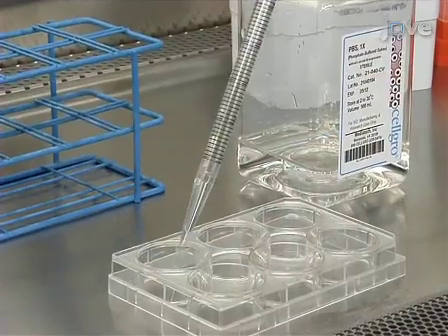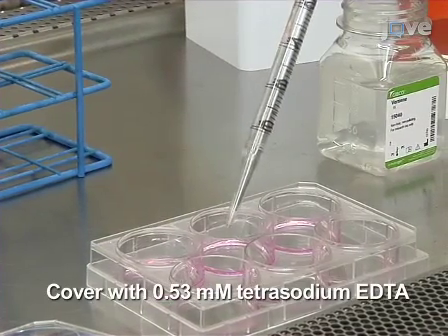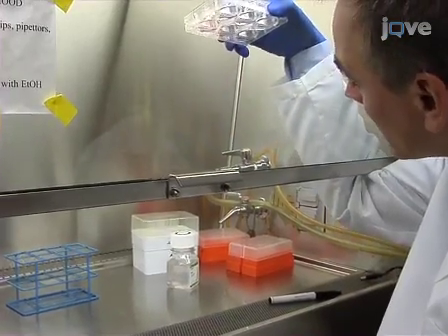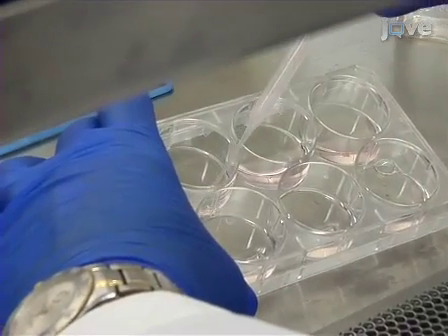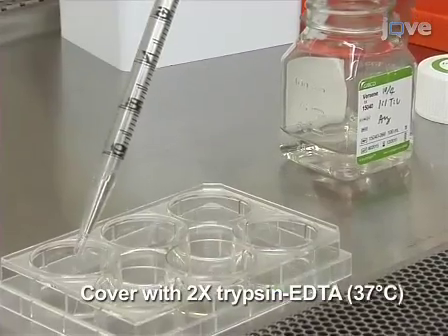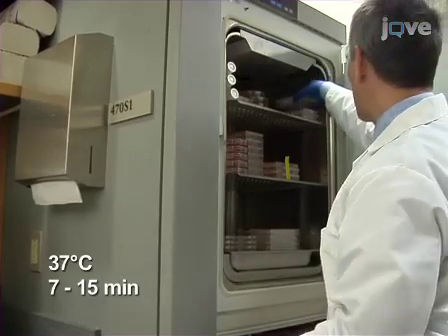To passage the stem cells, the feeder cells must be removed first. Wash the cells once with PBS and add enough room temperature 0.53 millimolar tetrasodium EDTA to cover the cells. Incubate at room temperature for 5 minutes. After the incubation, gently shake the dish and the 3T3-J2 feeder cells will detach. Aspirate off the feeder cells and rinse the plate of stem cells with PBS once. Then add enough pre-warmed 37 degrees Celsius 2x trypsin-EDTA to each well to cover the cells.